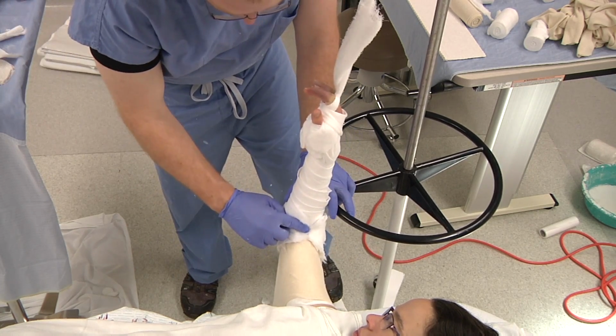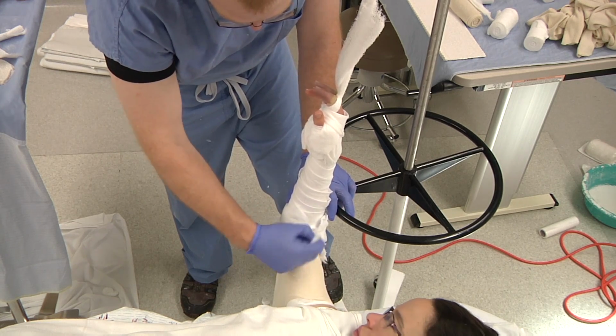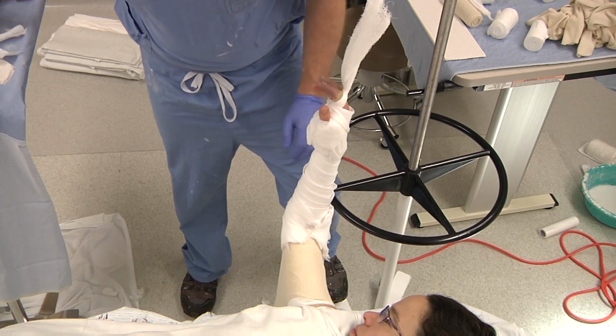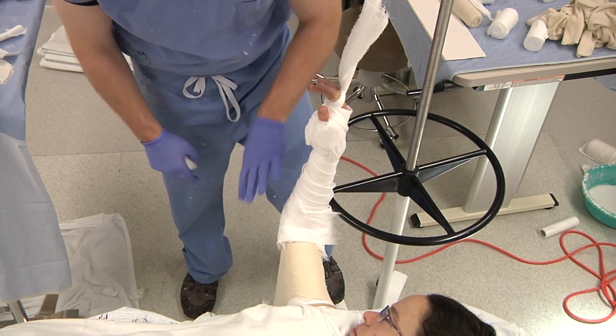Also, watch out that you don't get too much material in the cubital fossa. If you do, easy, pluck, pluck, pluck, pluck, pluck. Throw that out. You can even go down to skin and then just put a piece over top to tie it all in together.